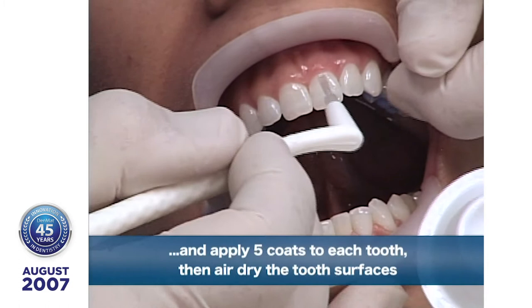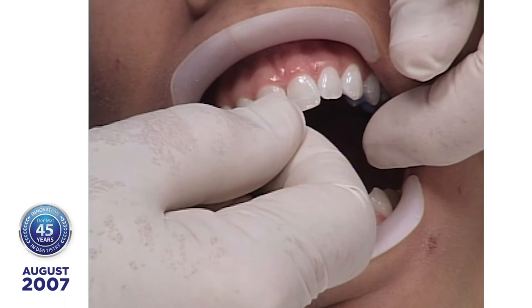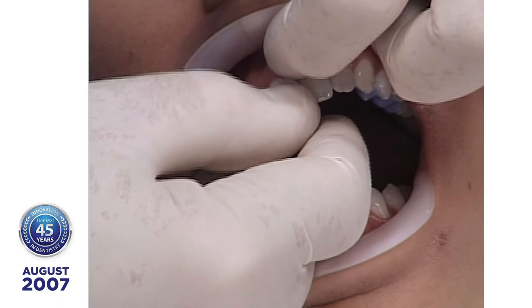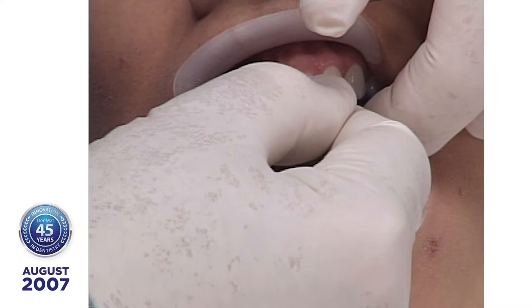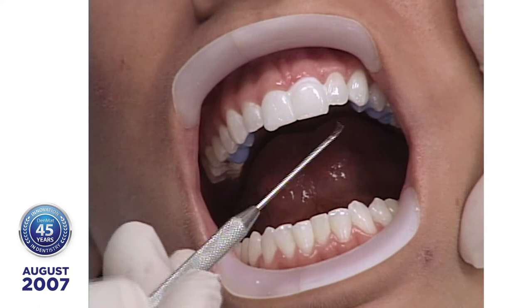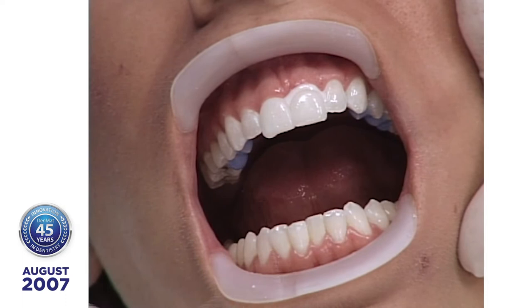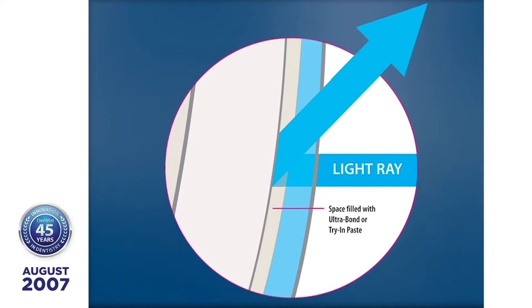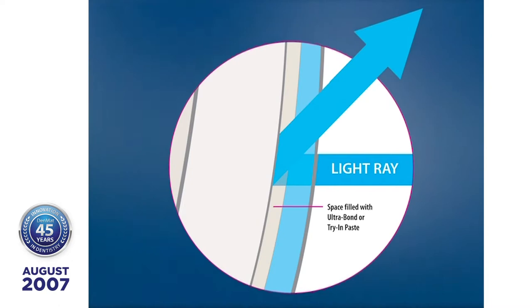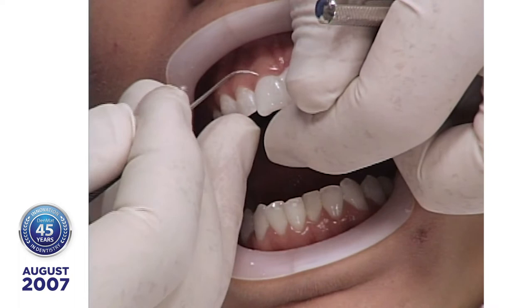We've already selected a shade on the patient. Jessica always calls out the name of the tooth. I want to show you the difference between the shade of the lumineer with the tri-in paste and without — both will be the same shade ultimately. The one on the left has ultrabond tri-in paste, which will be the true color we end up with. Without the tri-in paste you get a different color because light going through a medium bounces back at the critical angle, giving a reflection on the etched porcelain surface. To get the true shade, use the ultrabond tri-in paste. It contains all the same ingredients as ultrabond except it has no activator. Do this before you put tenure-S on the teeth.